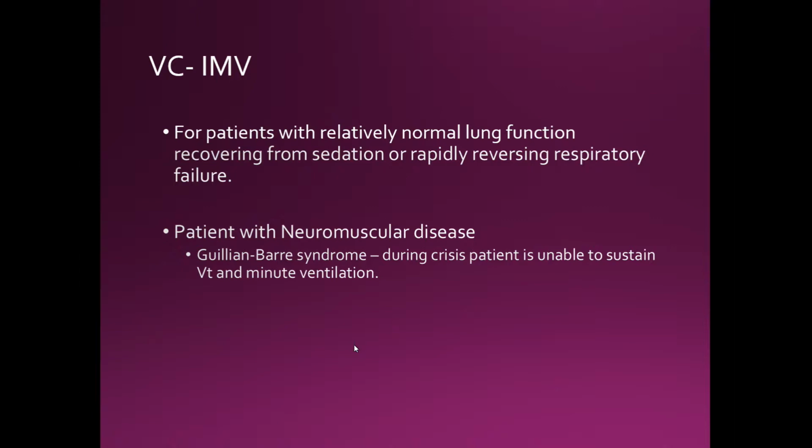So even if I'm at 127 mLs, that's my tidal volume by myself. And if you start seeing that on the patients, you know that that is not adequate volume, therefore it's not going to be an adequate ventilation. So what you would do to correct it is add pressure support.